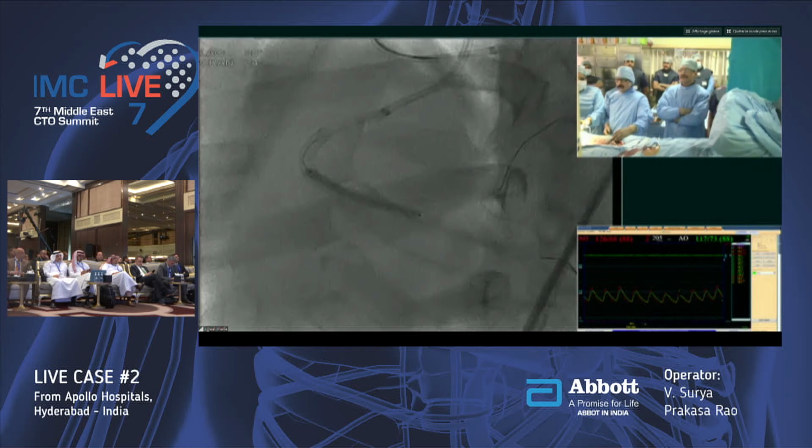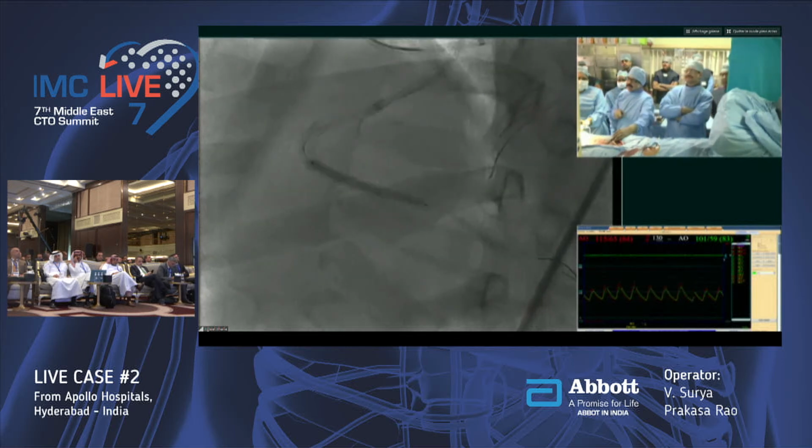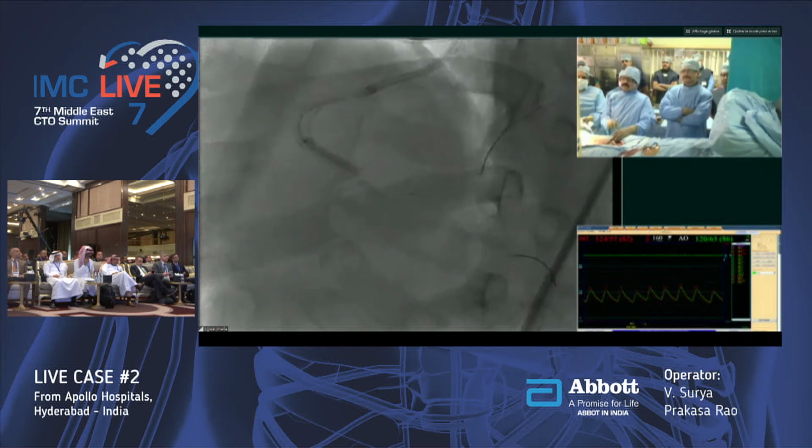Please. You are absolutely right. There is some staining on the PLV. Yes, we get the PLV exposed in the ISR on retrograde injection, but it is retrogradely filling from the left system. So whether we should open it antegrade with a Crusade is another step. We will discuss that.